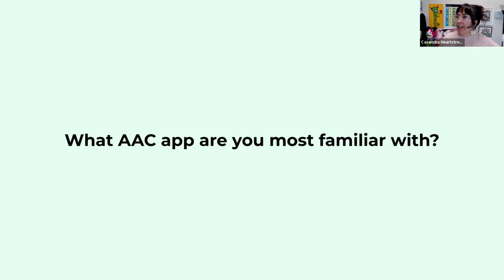I'm seeing a nice range here. TouchChat, TD Snap, Lamp, Tobii Dynavox devices.